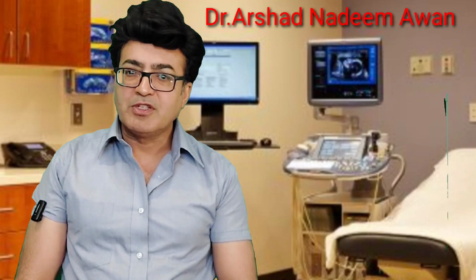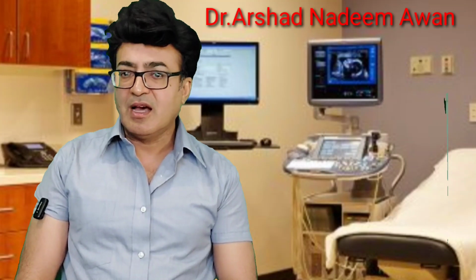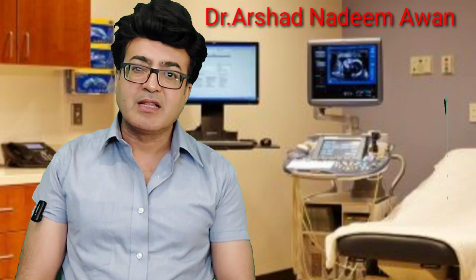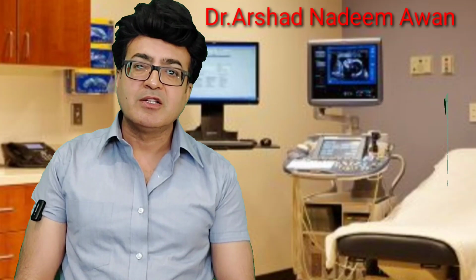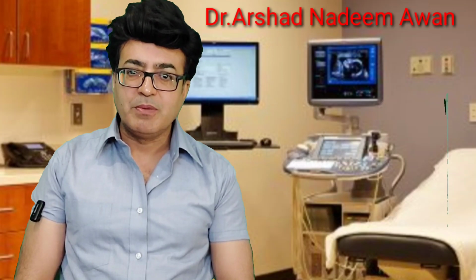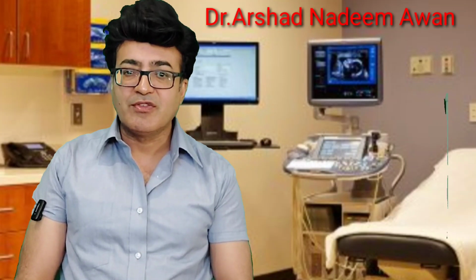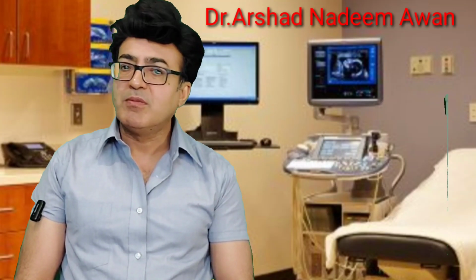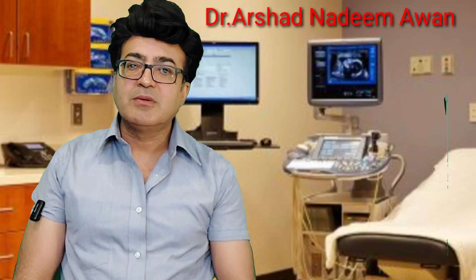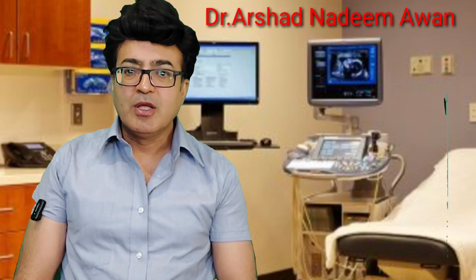PID usually happens soon after inserting the IUCD. There is a chance in the early days of the insertion of the IUCD that one may get pelvic inflammatory disease. That's why after an IUCD it is important to follow up after 2 or 3 weeks to look whether it is normally placed or if there is any infection within the endometrium. And if there is infection, it will definitely be PID, because PID includes inflammation of the endometrium. That may be because of insertion of the IUCD. Some infection may ascend upward up to the endometrium during the process, and it may lead to PID.